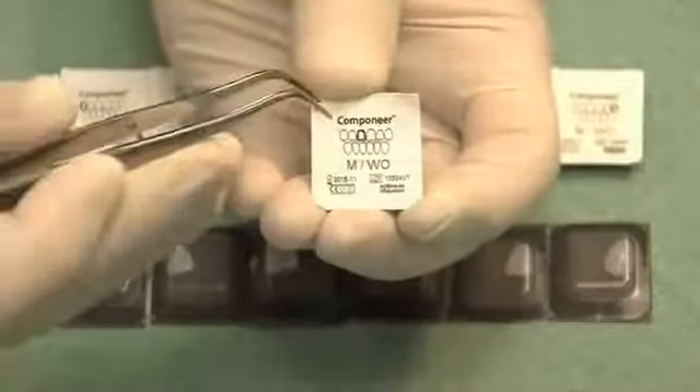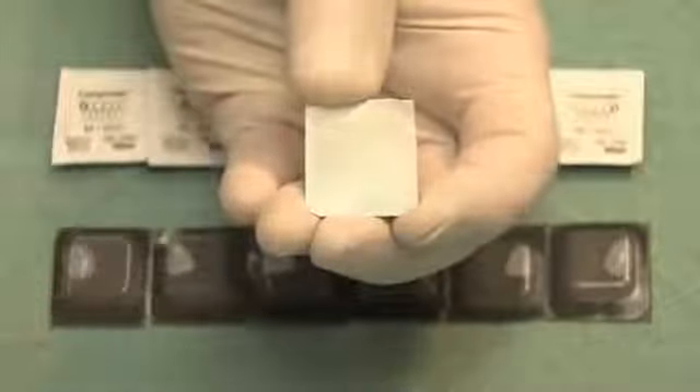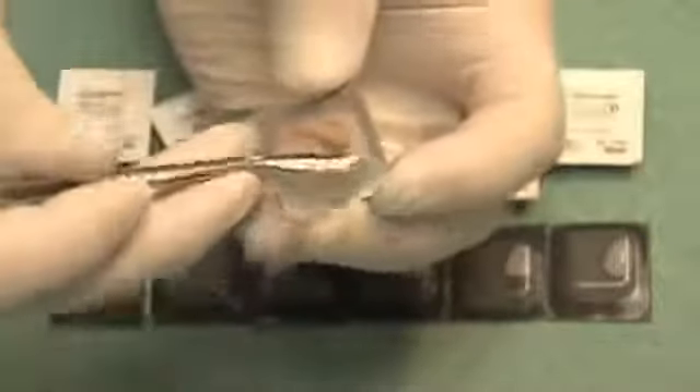The Componeers are individually packaged; the sheet on the reverse side serves for patient documentation. The Componeer is removed from packaging with a pair of tweezers.